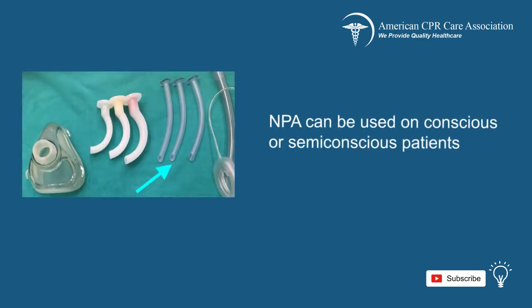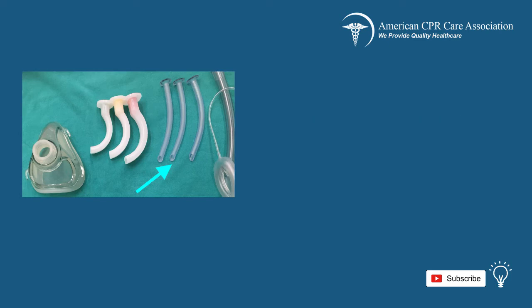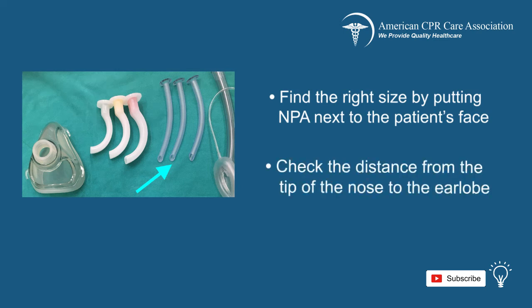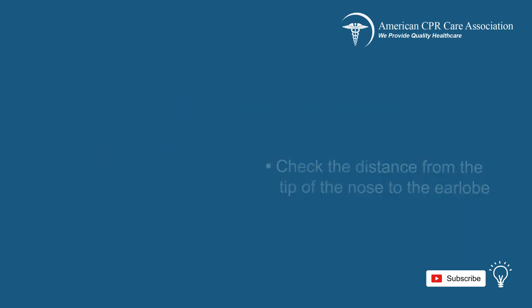The nasopharyngeal airway, or NPA, can be used on a conscious or semi-conscious patient. To use this airway device, first find the appropriate size by placing the NPA next to the patient's face and checking that it is equal to the distance from the tip of the nose to the earlobe. It is imperative to use a proper size for the NPA, as the wrong size NPA can go into the esophagus and cause gastric inflation.